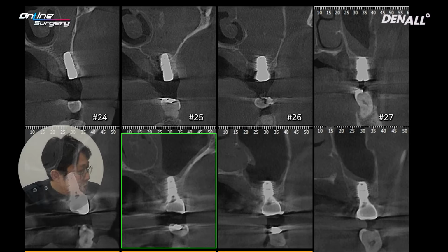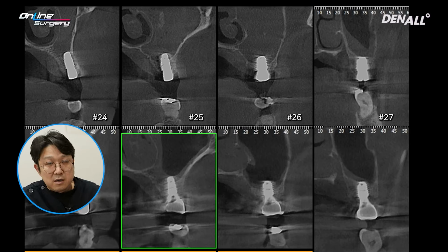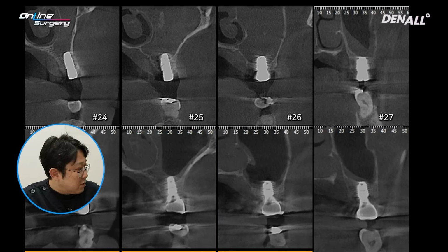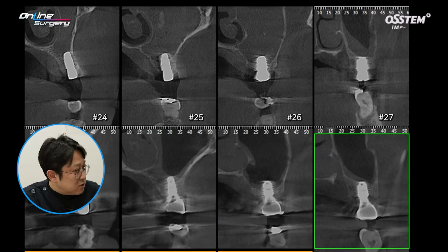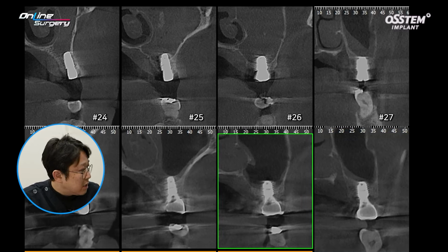In number 24, there was sufficient residual bone, so it will be maintained without a problem. The implant was placed in number 25, and you can see that there is significant contact between the residual bone and implant. Over about two-thirds of the implant is in contact with the residual bone. So I think the prognosis will be nice. It's the same with number 27. There was quite significant residual bone, but the problem is with number 26. It had the least amount of residual bone.